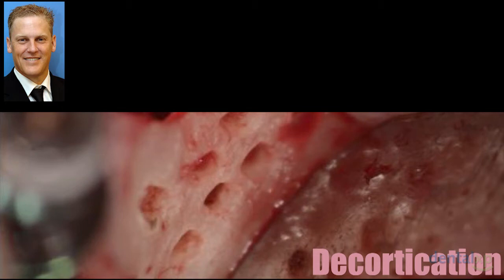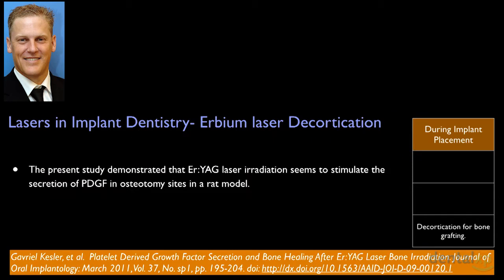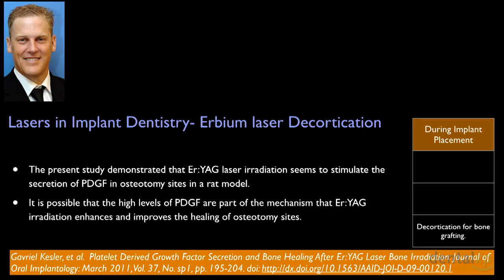Traditionally, for guided bone regeneration, we are forced to go decortication with burrs. Kessler and his group have shown that with using an all-tissue laser, there's an increase in the release of PDGF from within the bone marrow spaces. And they postulated that this mechanism might explain why erbium laser radiation enhances and improves the early healing of osteotomy sites.